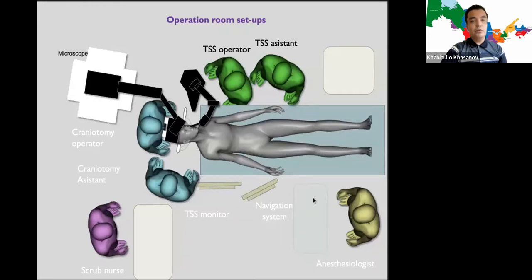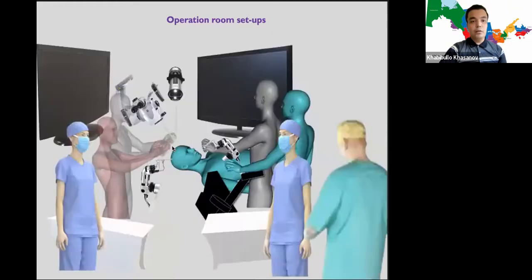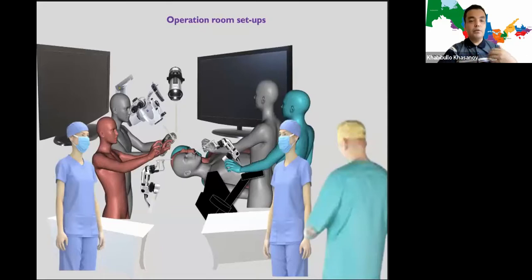It is not difficult for the endoscopic and nasal team to perform the endoscopic approach, even as the patient's position and head are situated according to the transcranial surgery team's preferences. But the use of a microscope is a bit limited. So with the advancement of endoscopic or exoscopic systems, this limited space can be improved.